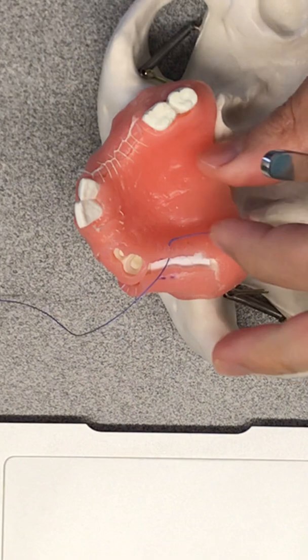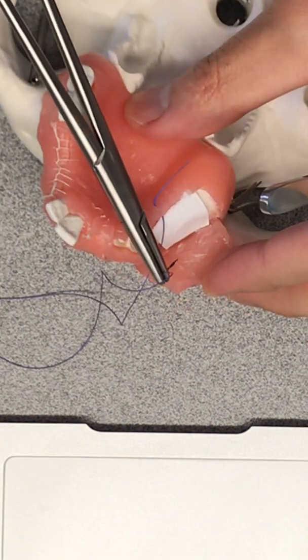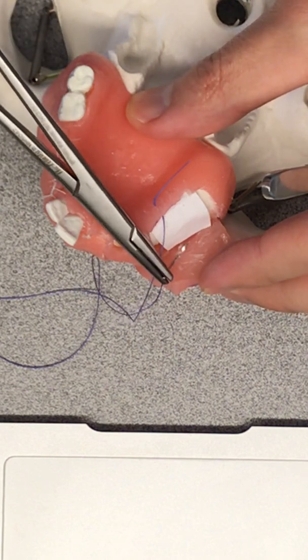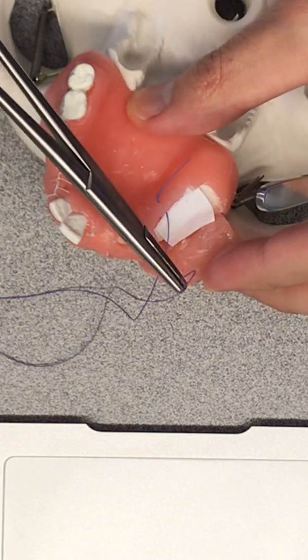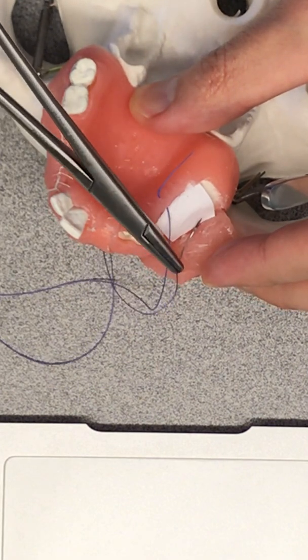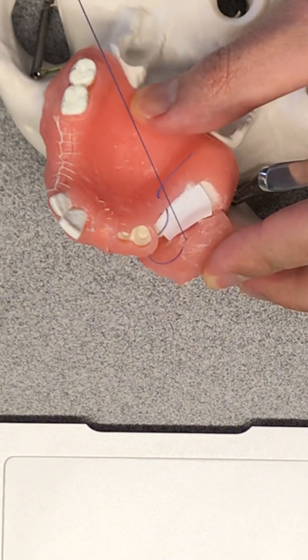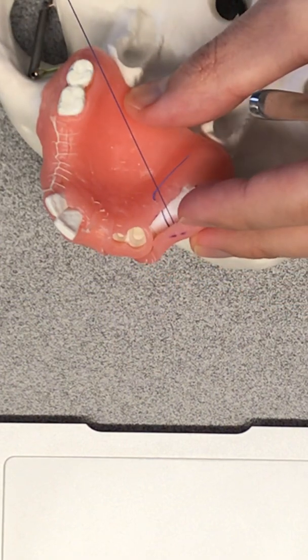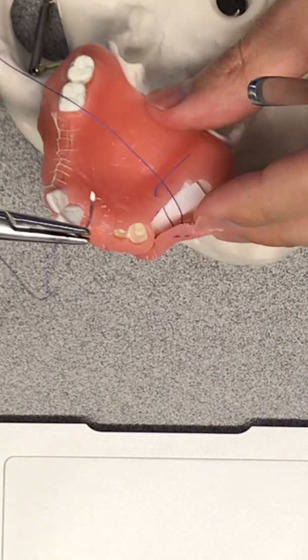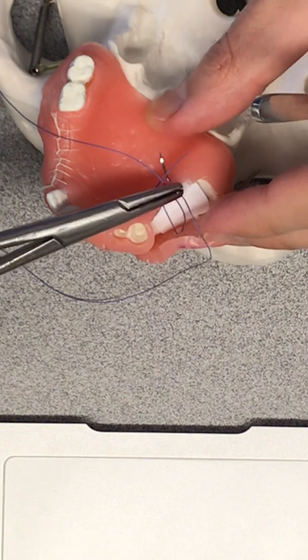Afterwards, we try to grab the periosteum, then return to the palatal flap — connective tissue to epithelium.